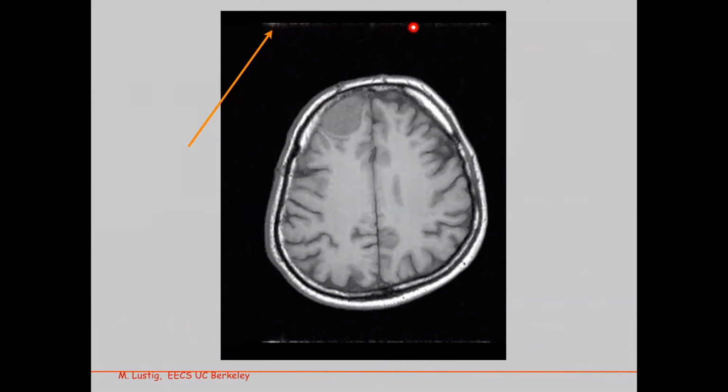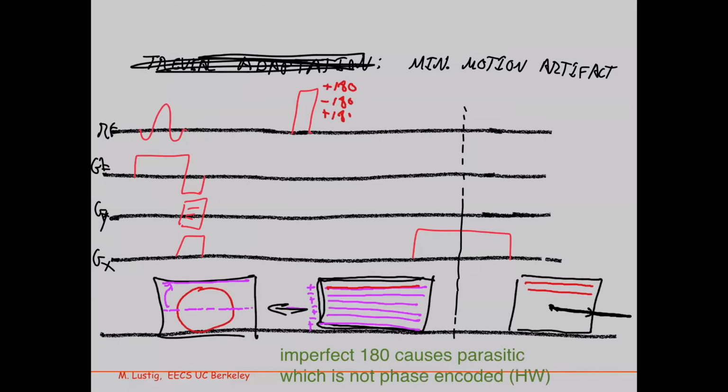And then you can kind of see those effects. See? Pretty cool, huh? I have a question. Yeah. All the way back in step 1, why do you get some new spins when you don't have a perfect 180? Oh, okay. So this excites a slice.